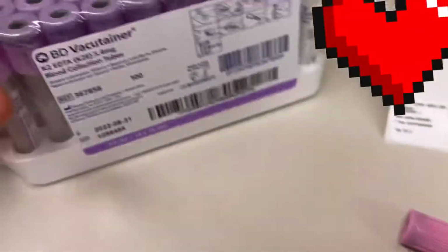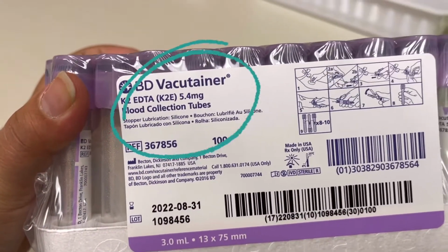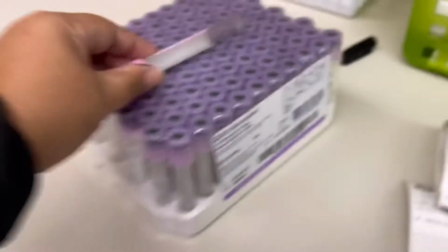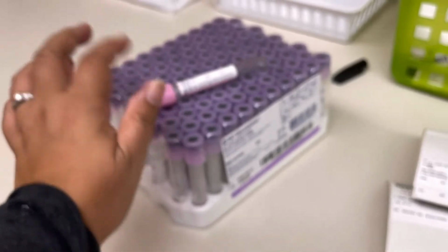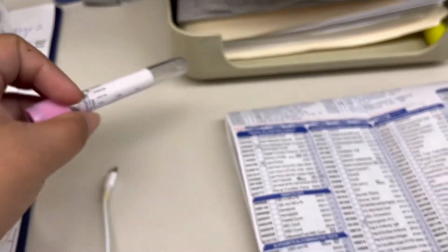And this one, how much? 5.4 milligrams, so double it. So this and this are just the same, it's just a little bigger. And this is the tube that you use to collect blood samples for blood typing or blood bank.